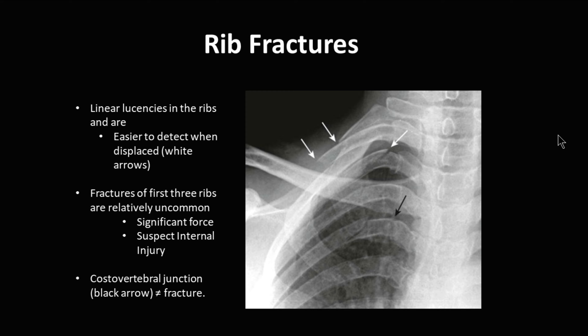Rib fractures are oftentimes very difficult to find. You see them as linear lucencies within the rib. They're easier to see when they're displaced. You can see here the right arrow shows a displaced rib fracture. If you have fractures within the first three ribs, this is uncommon because it takes significant force, as those ribs are sandwiched between the clavicle and the scapula.